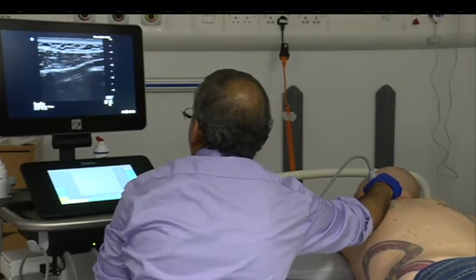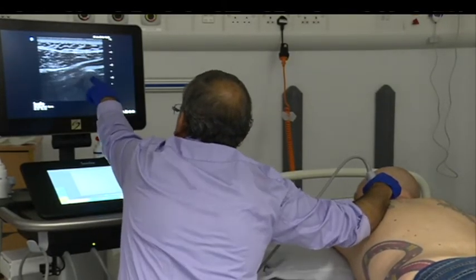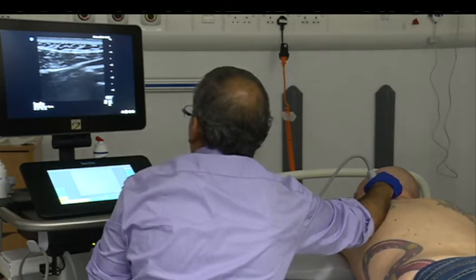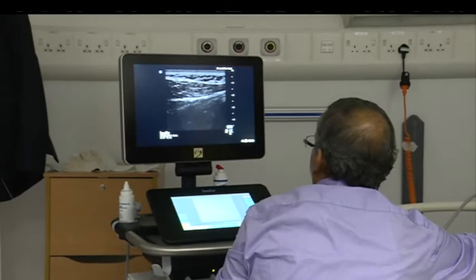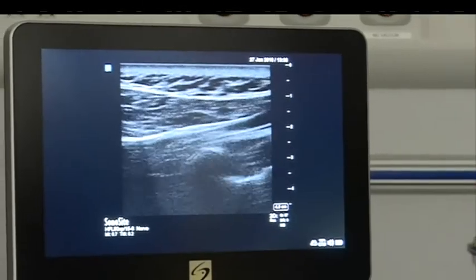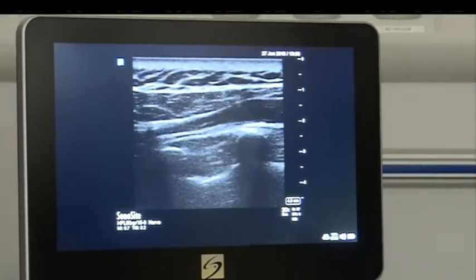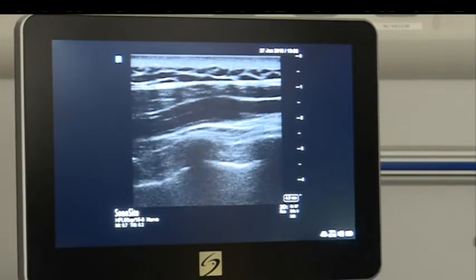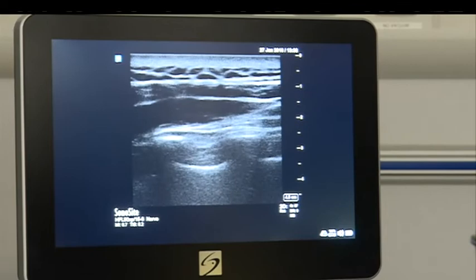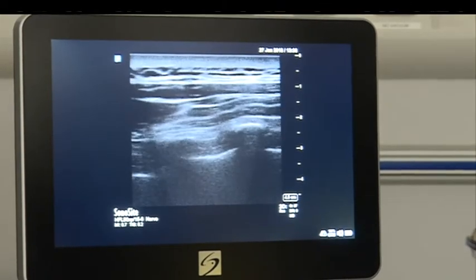You count the ribs — basically these are the shadow of the rib, hump-like. So there is no hump we can see cranially — that is your first rib. Then you get a second rib. It will get slowly much more superficial as you go down. That is your third rib and that is your fourth rib.